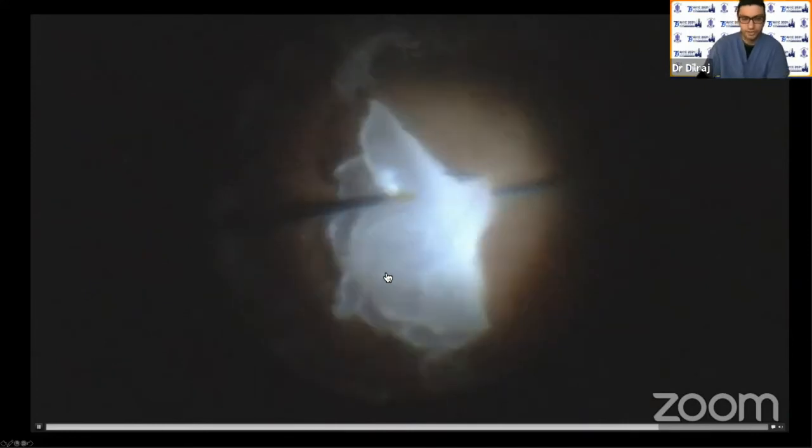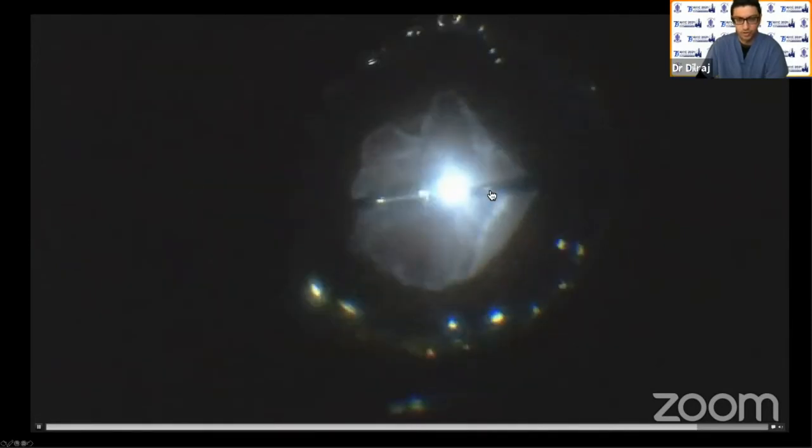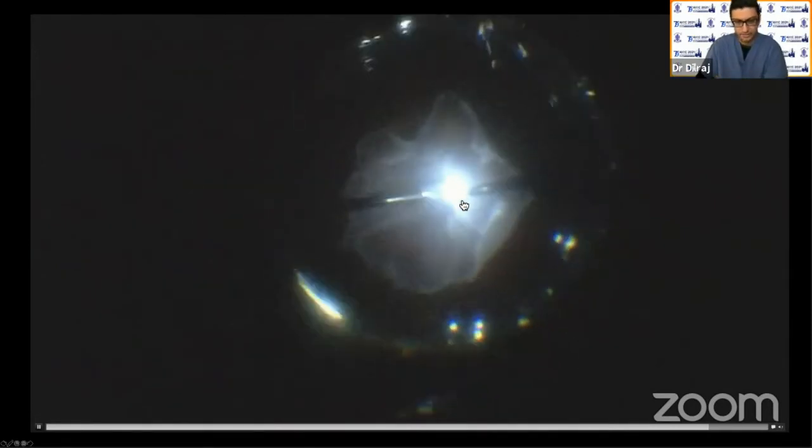In these cases, if you are in a situation where you've already performed a 360 retinectomy and now your retina is very mobile, you do want to ensure that you've removed all subretinal bands and membranes.